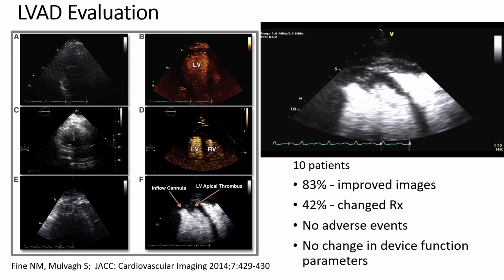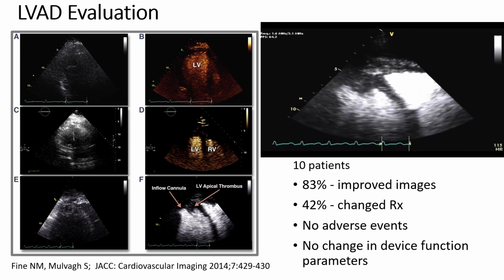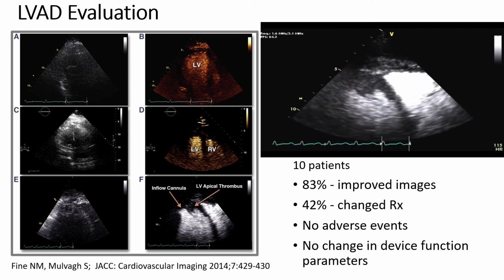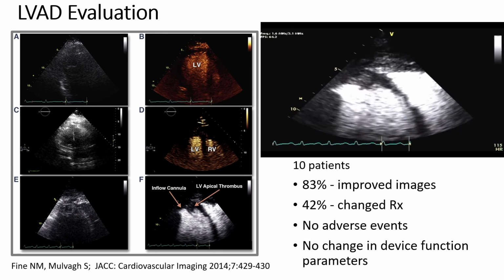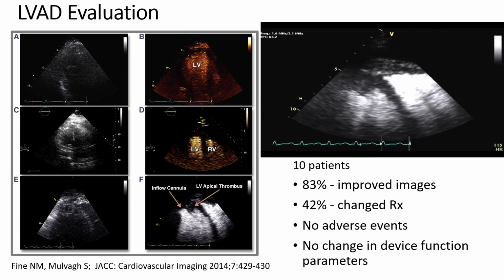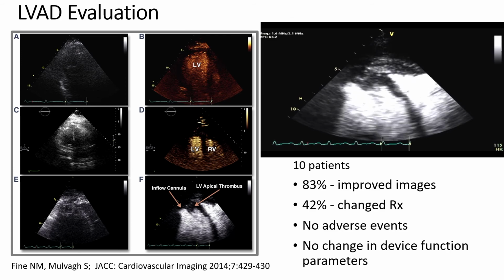What about using contrast echo in the assessment of patients with assist devices or circulatory support? We looked at our Mayo experience several years ago when Dr. Noel Fine was an echo heart failure advanced fellow with us, and found that the use of contrast appeared safe and useful.